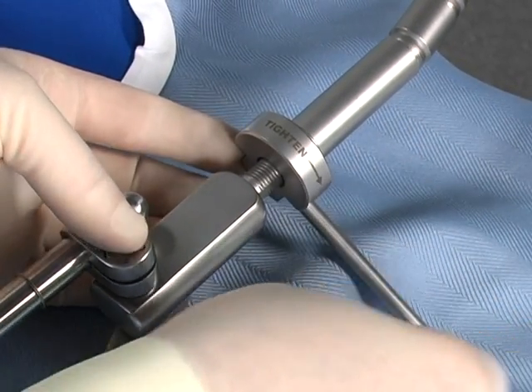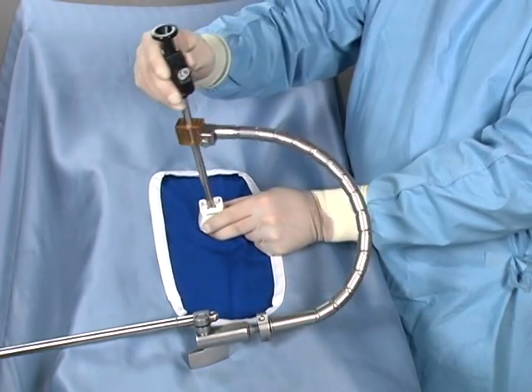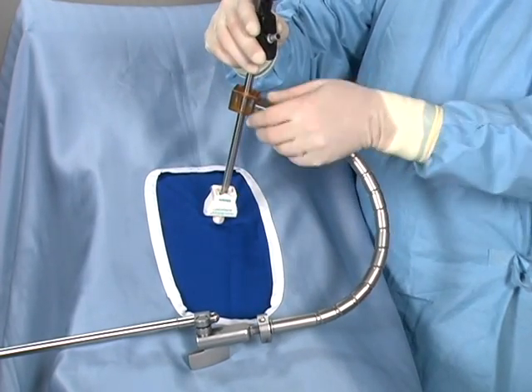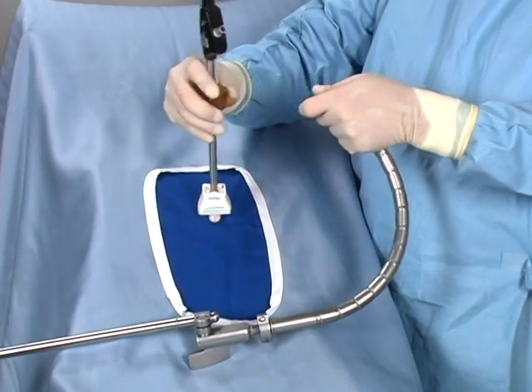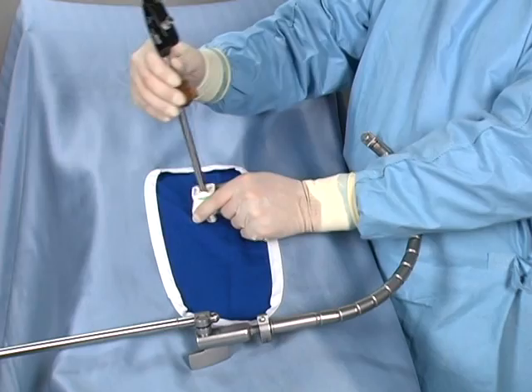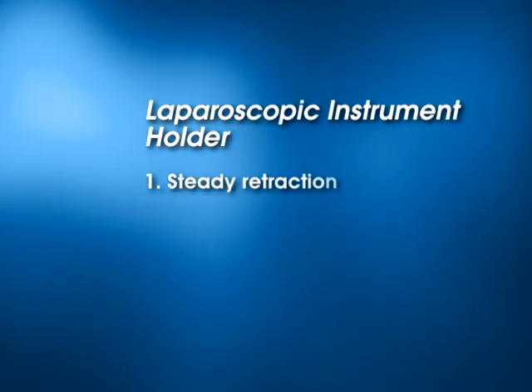Conversely, turning the lever counterclockwise lessens rigidity. The Thompson FlexBar Scope Holder allows you to maneuver the laparoscope in an unlimited number of planes without having to loosen or tighten wing nuts or tension devices. Large sweeps can be facilitated by disengaging the scope clip from the arm.